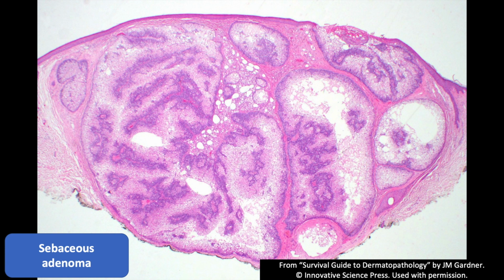Now, this is in contrast with the sebaceous adenoma, and the big difference here is there are more prominent blue basaloid cells around the outside. You can see the entirety of these nests are surrounded by a thicker layer of blue basaloid germinative epithelial cells. This one also has some cystic spaces, and sebaceous adenomas, as many of you probably know, are sometimes associated with Muir-Torre syndrome, which is basically so-called Lynch syndrome or hereditary non-polyposis colorectal cancer syndrome with the addition of sebaceous neoplasms of the skin.